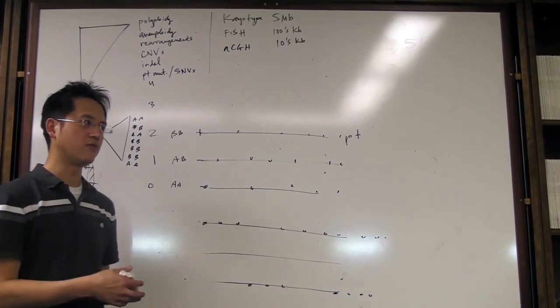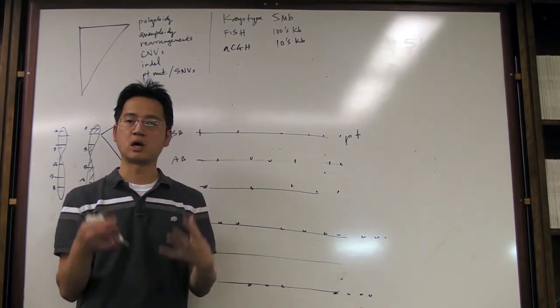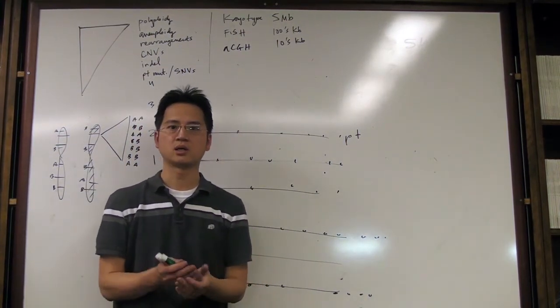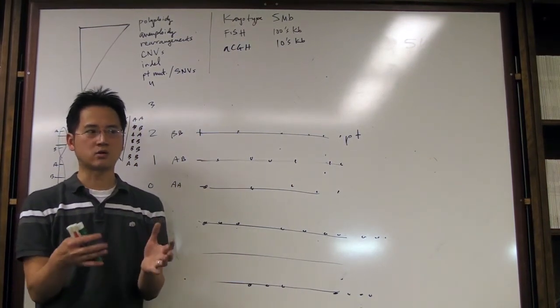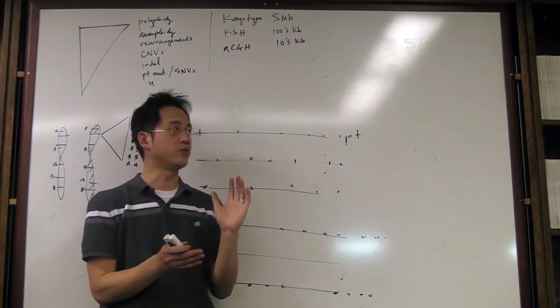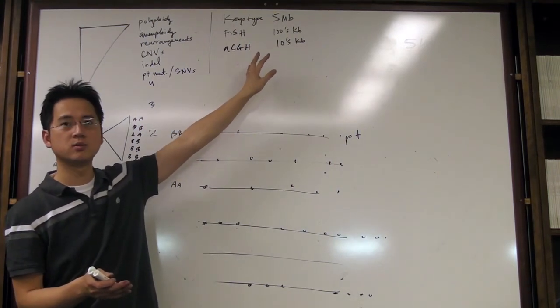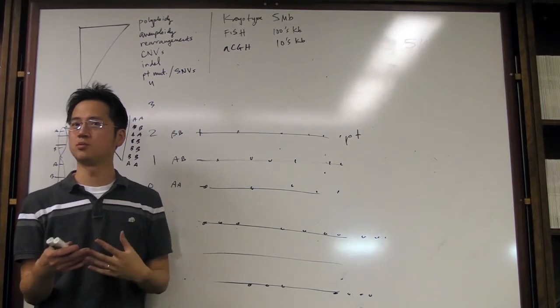Copy number, I think if you pick the right population in terms of patients, let's say folks showing autism, developmental delay, intellectual disability, congenital malformations, dysmorphic features, if you pick that group correctly, our hit rate so far has probably been around the 10 to 15% range. Whereas for these folks, karyotype will only pick up maybe 1%, 2% at most. FISH, depending on what you're looking for, maybe 1 to 2%.